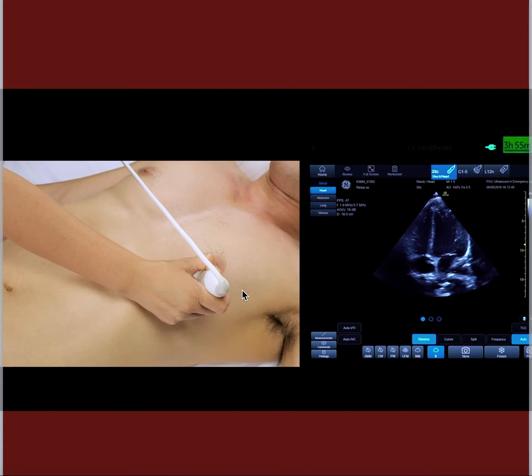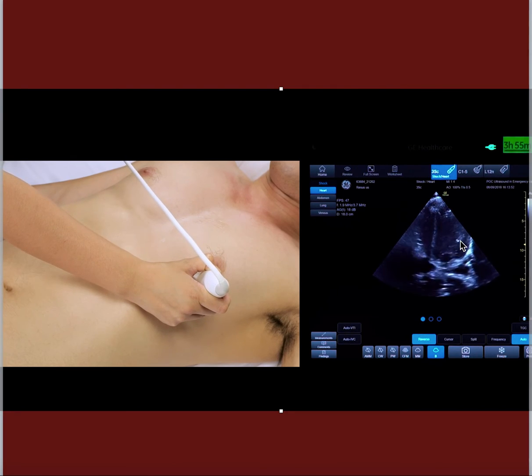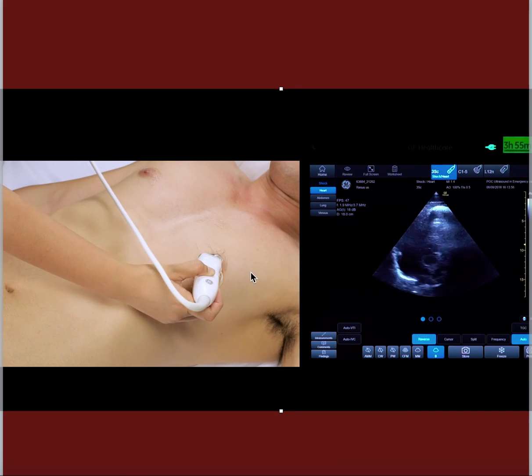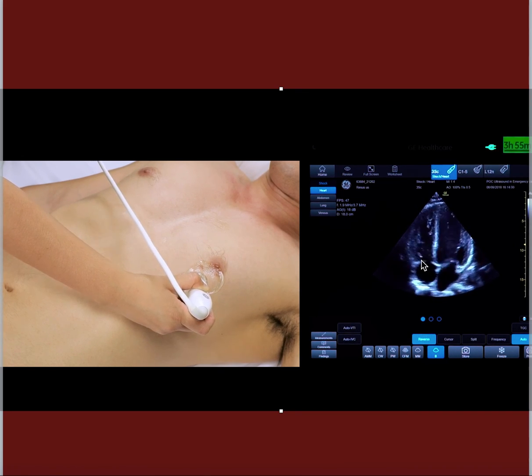In the video, when the probe is positioned too high, you get a blunted LV — it looks a little fatter. But if you pull the probe down one grip, you get the bullet-shaped LV. So be careful to avoid this mistake.